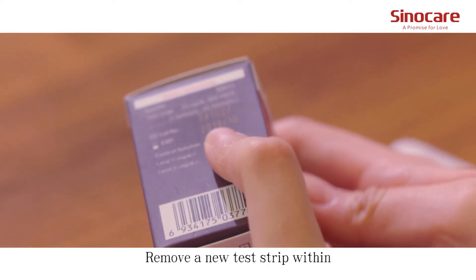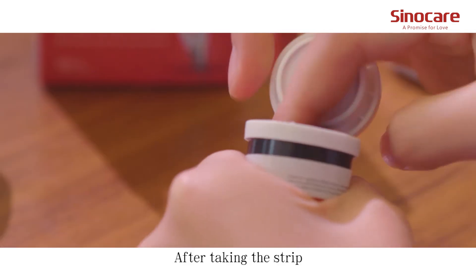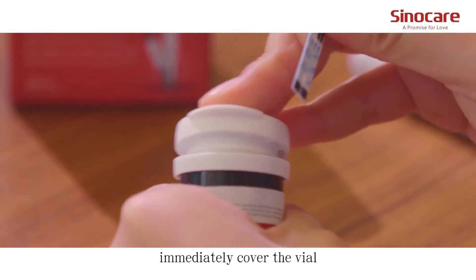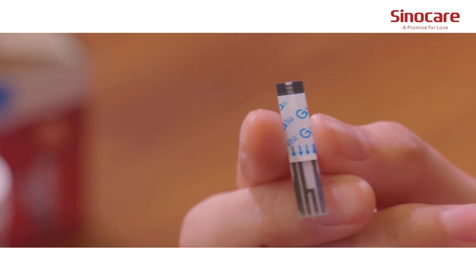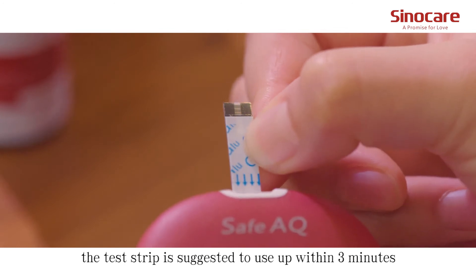Remove a new test strip within the valid expiration date from the vial. After taking the strip, immediately cover the vial to avoid loss of efficiency. Insert the test strip into the strip slot. The test strip should be used within 3 minutes.